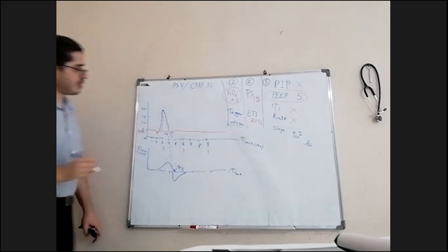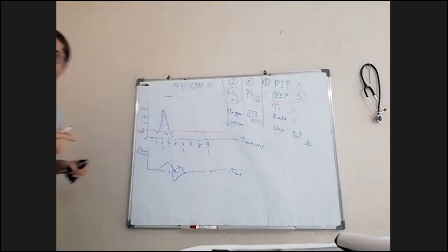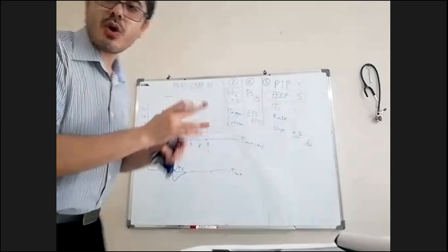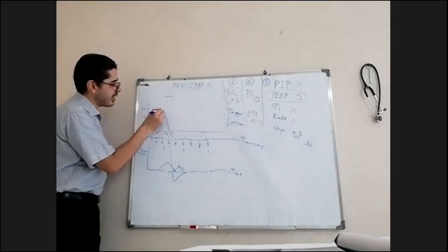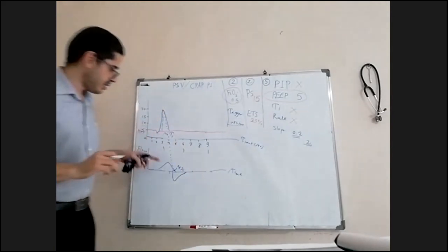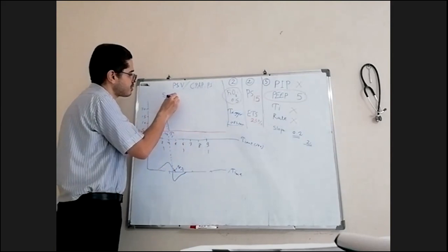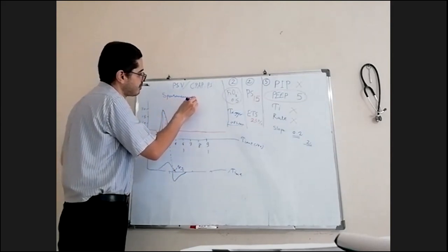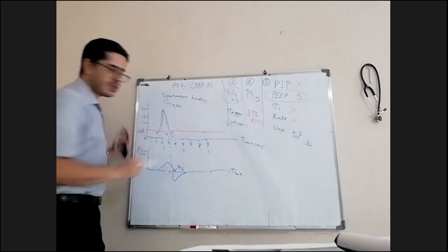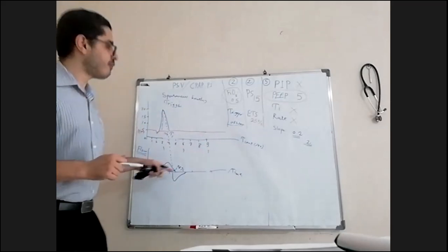So it is not PI. So you will notice here, you will not see flat line on the top. If you see flat line on the top, means the breathing is either controlled or assisted. But here, you will not see flat line. Pressure support, you'll see only pointed top. There is no TI. So again, this is spontaneous breathing. What is the trigger? Trigger is the flow trigger of the patient and cycle also, yeah, from the patient.